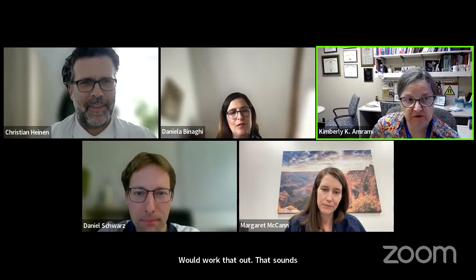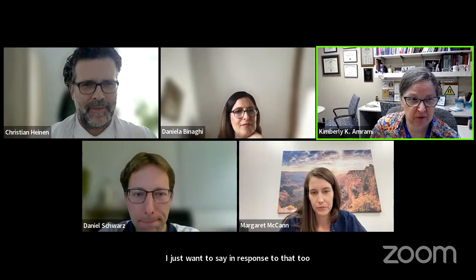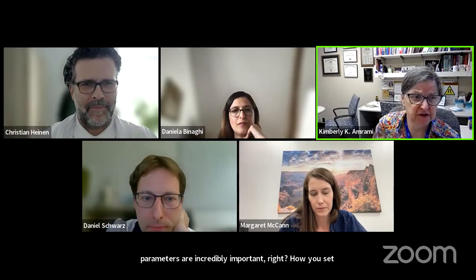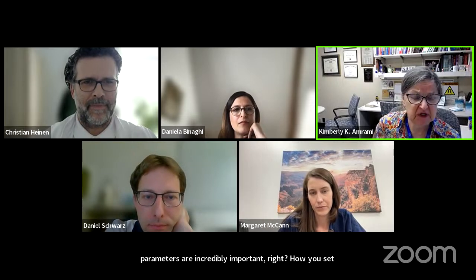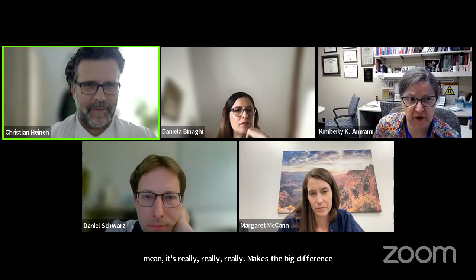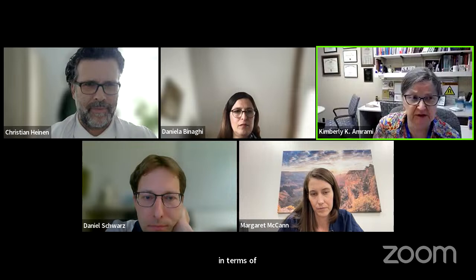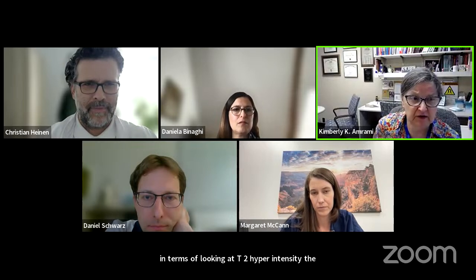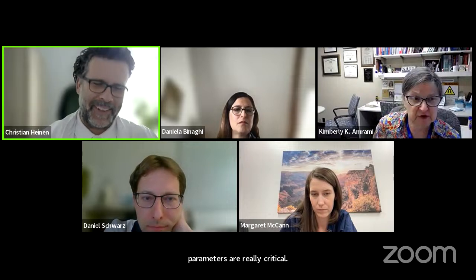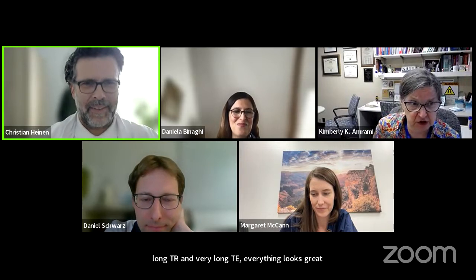I just want to say in response that your parameters are incredibly important. How you set your TR and TE, and whether you're using some kind of inversion pulse, makes a big difference in terms of looking at T2 hyperintensity. The MR parameters are really critical. If you have very long TR and very long TE, everything looks great, and that's sort of a problem with STIR imaging too.